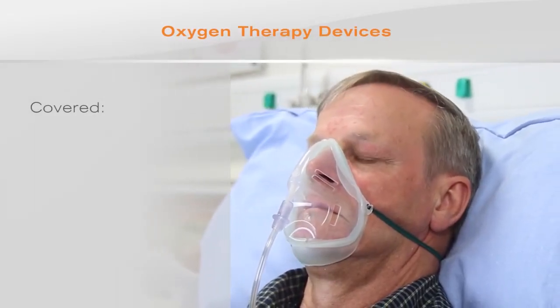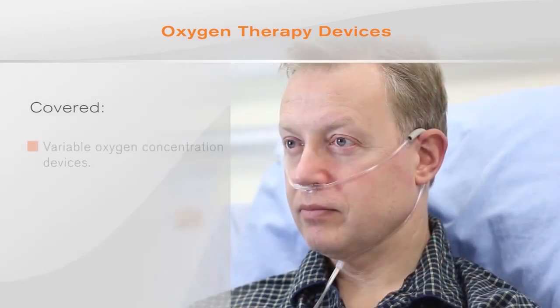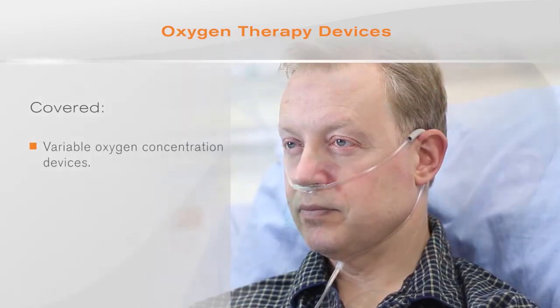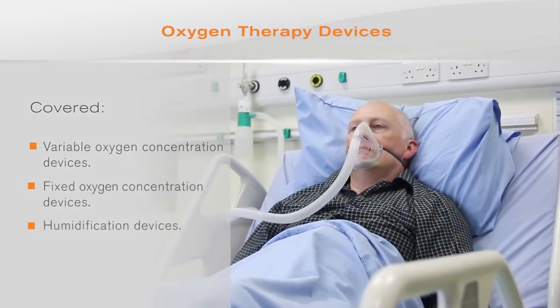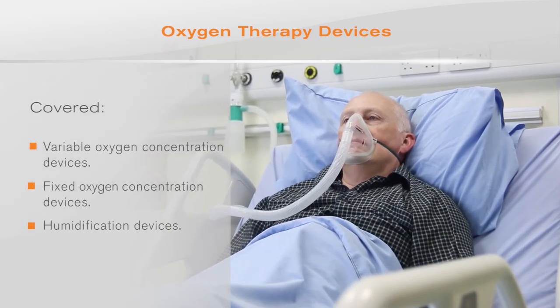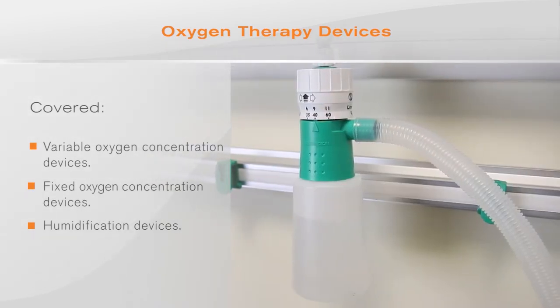To summarise, we have looked at many different oxygen therapy devices, including variable oxygen concentration devices, fixed oxygen concentration devices, and humidification devices. We hope this has helped improve your understanding in this important discipline.